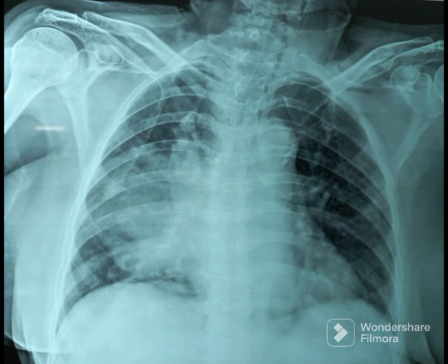You can note an opacity in the right mid zone and right lower zone. Using the Silhouette Sign, we can confidently say the pathology is in the right middle lobe. Even though some part of the opacity is very low down, it is not in the right lower lobe because the right hemidiaphragm is clear. Only the right heart border is silhouetted, hence the pathology should be in the right middle lobe.